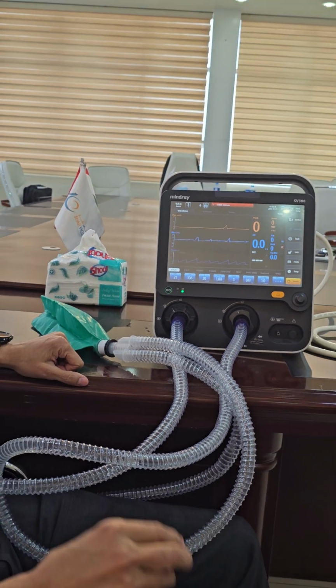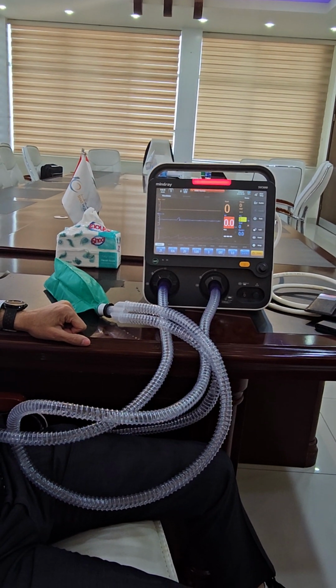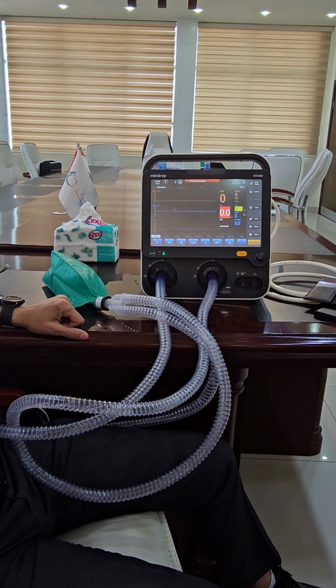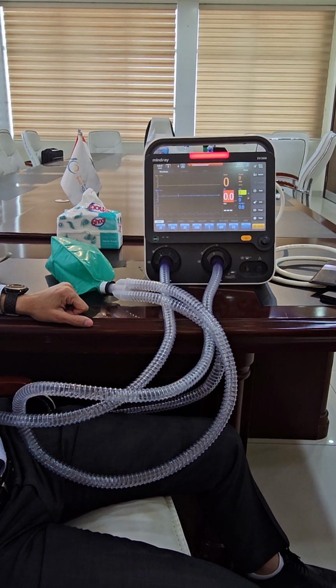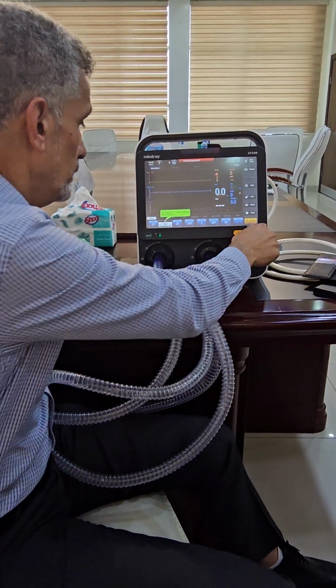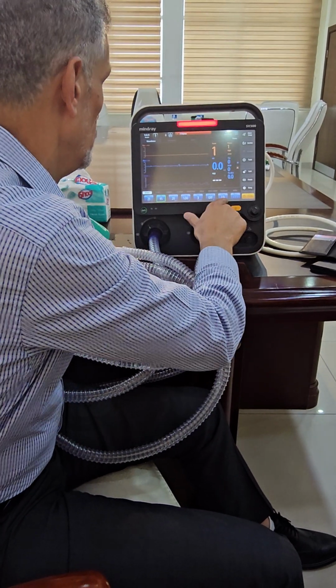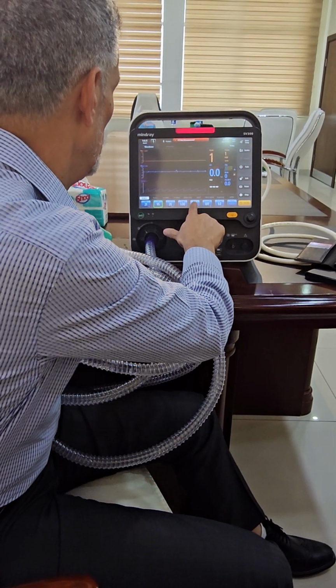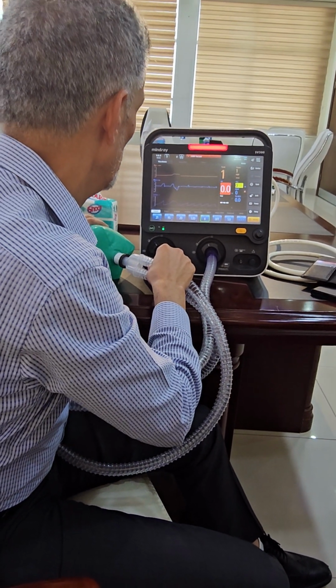Okay, so you guys remember the variables. We have three variables: control variable, phase variable, and conditional variable. Conditional is dependent and independent.